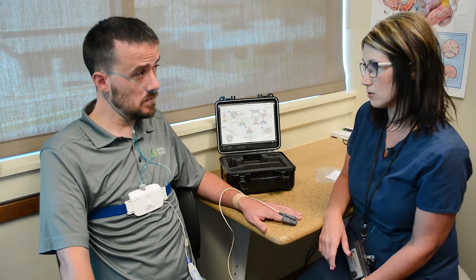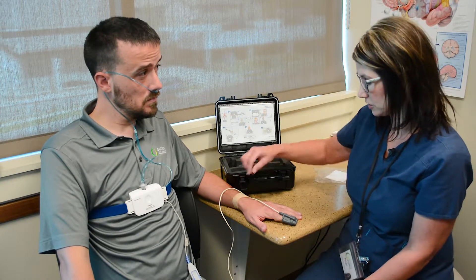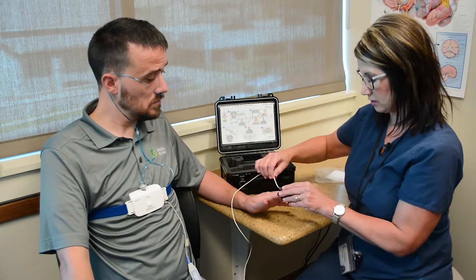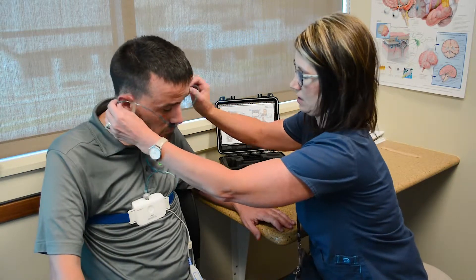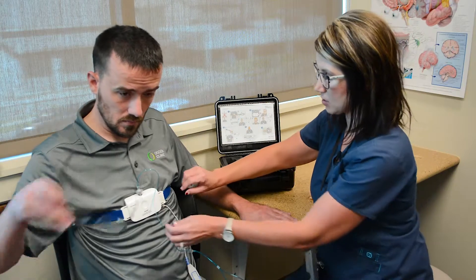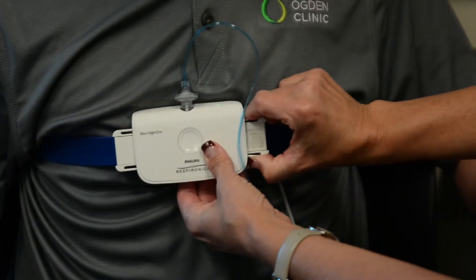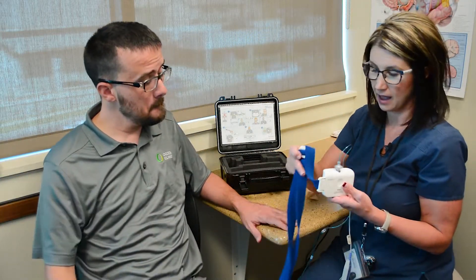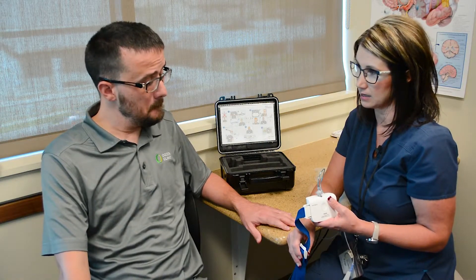We just want you to leave that on throughout the night. When you wake up in the morning, you'll start to take each sensor off. As you take them off, you're going to start to see the lights come on and they're going to start turning yellow. Then all you have to do is unplug this — the machine will turn off by itself after about 30 minutes, and then it's good to go again for the next night.